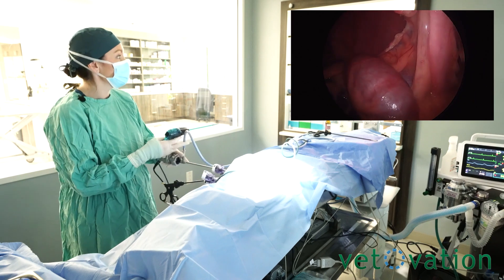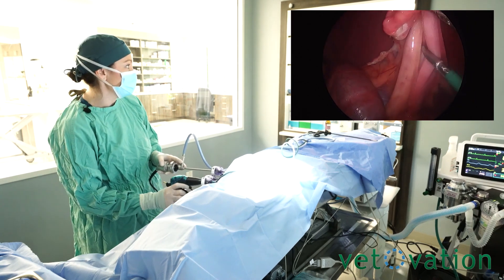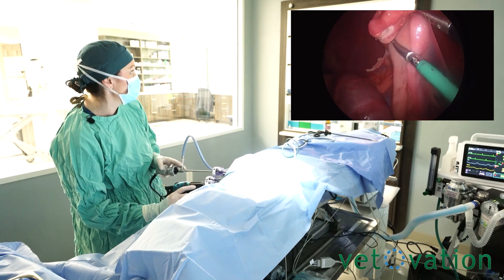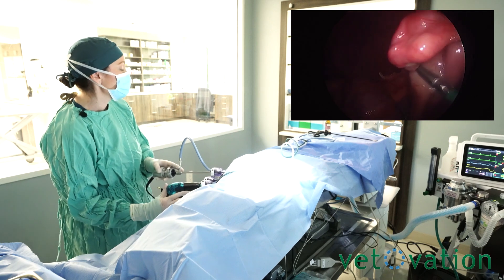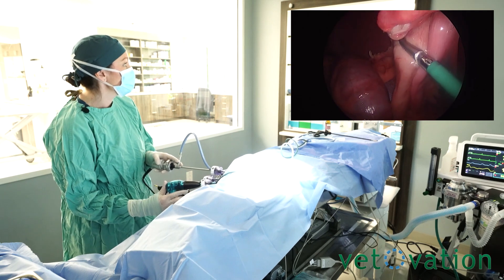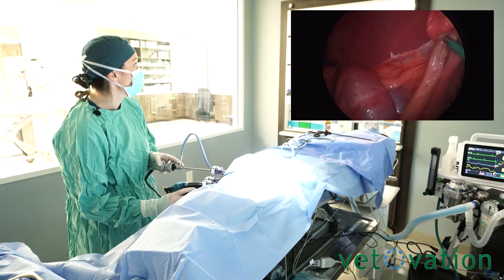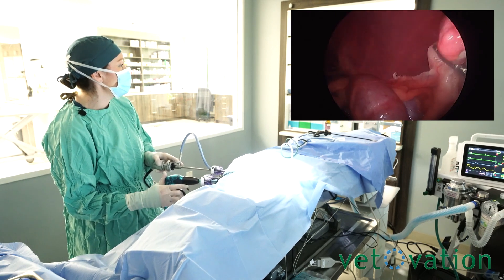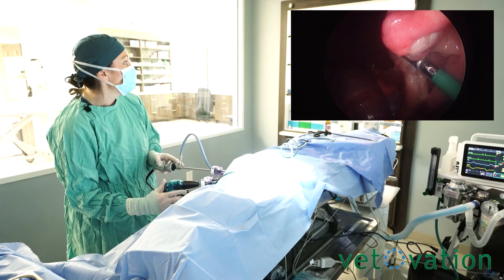My visualization was off here, but I may be able to go into this broad ligament here. Beautiful. You can have a video on a laparoscopic pyometra — this is exactly what I'm thinking.